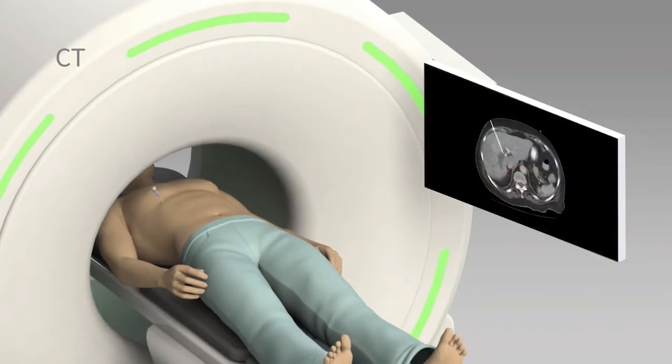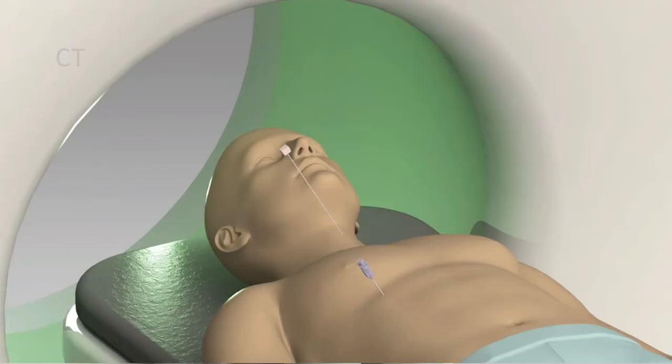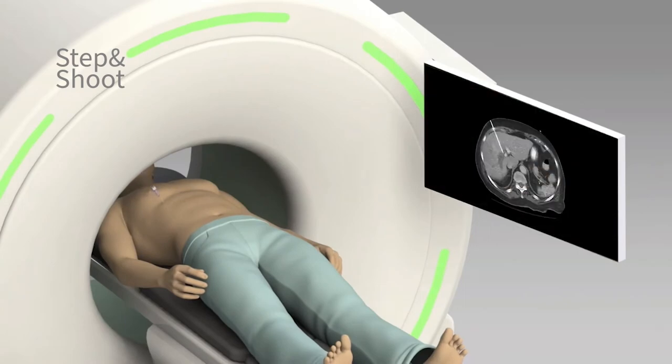If the position is not ideal, the instruments are repositioned. This adjust-scan-assess, or step-and-shoot procedure, is repeated until an ideal position is obtained.